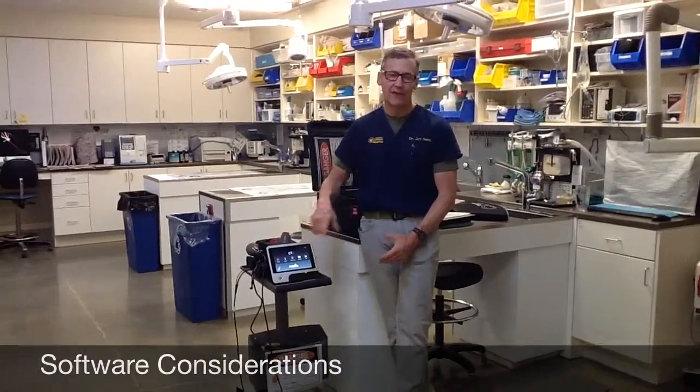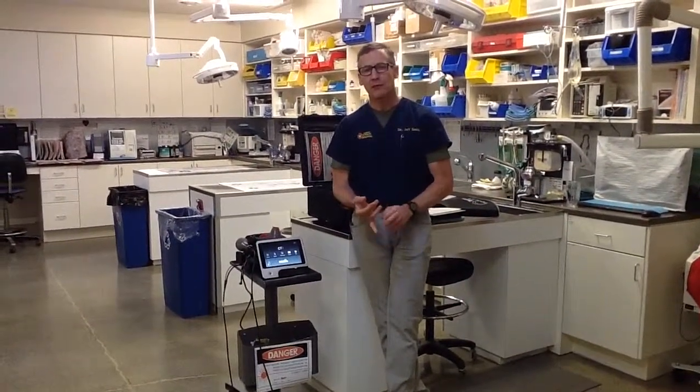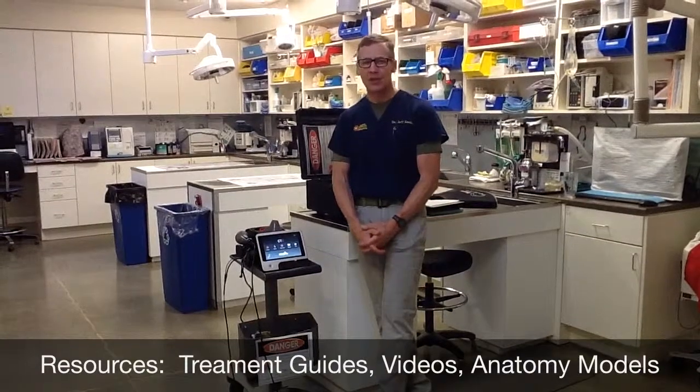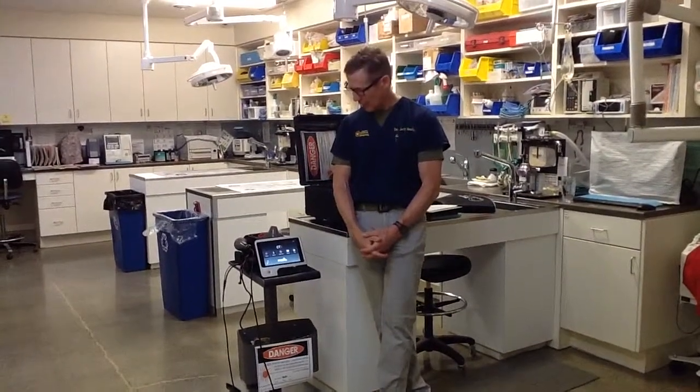The best way to learn the software is to navigate around on your own, like your iPhone. When you get your laser, go into the setup section first and pick the volume of the beeping noise and enable the finger switch — otherwise you have to hold the finger switch button constantly while lasering, which is very fatiguing. I usually have the aiming beam on constantly and set the emission sound to a beep at the lowest volume. Under resources you have a treatment guide, before-and-after pictures of treated animals, and an anatomy animation to show clients the area you're treating.